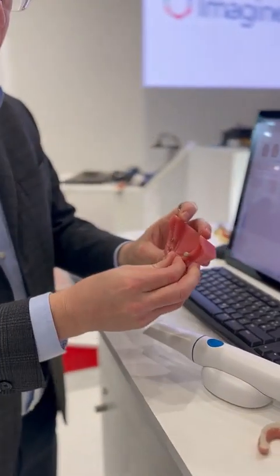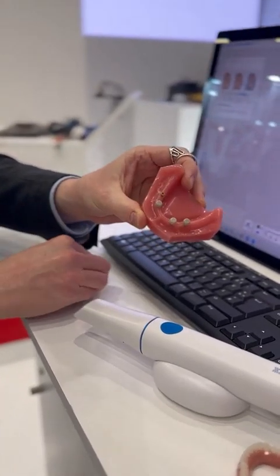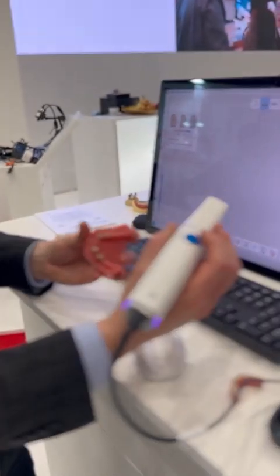I go ahead and pop these on here. We're gonna make this kind of quick because it's very easy with locator scan bodies. I just snap them right on top of my locator abutments, grab the scanner, make sure I have the mandibular scan turned on. With the i900 classic scanner, I can go ahead and click this button to begin the scanning process.